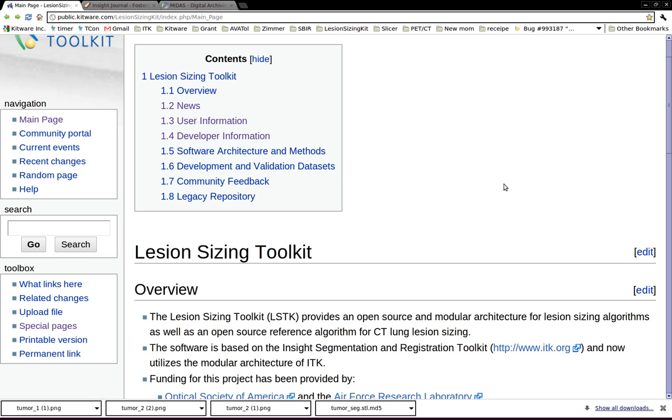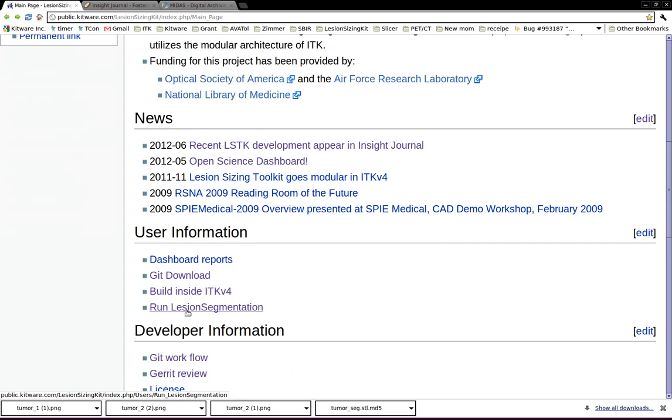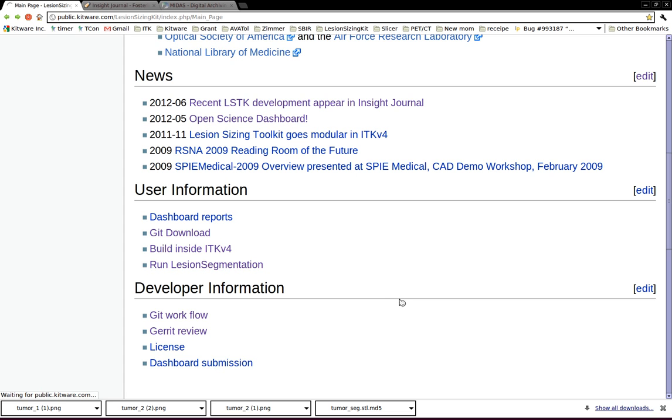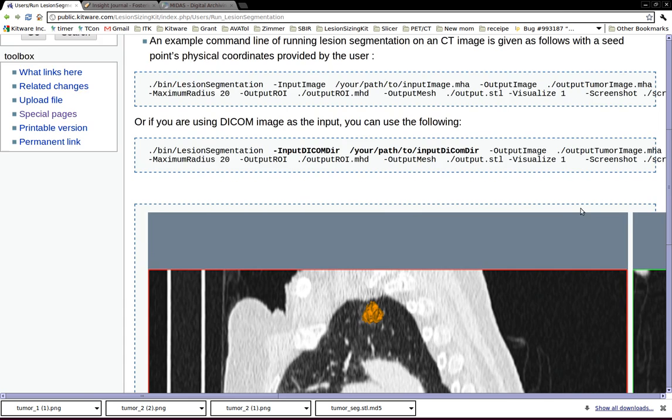This is the wiki page of Lesion Sizing Toolkit and you can find more information here. There's an example to demonstrate how to actually run the lesion sizing segmentation on a CT lung image. We have all the command line instructions here.